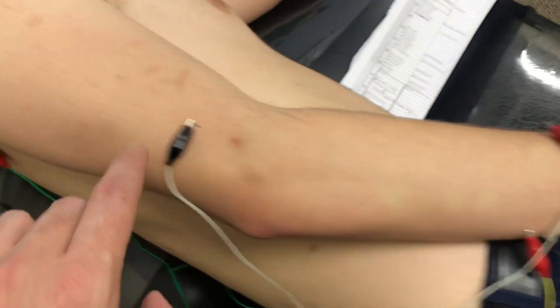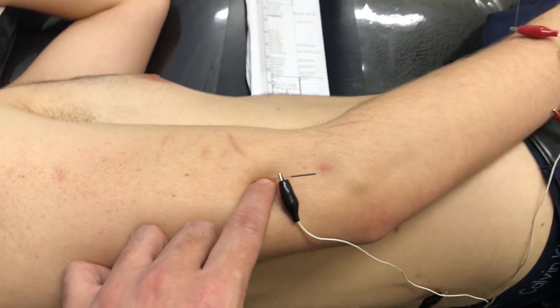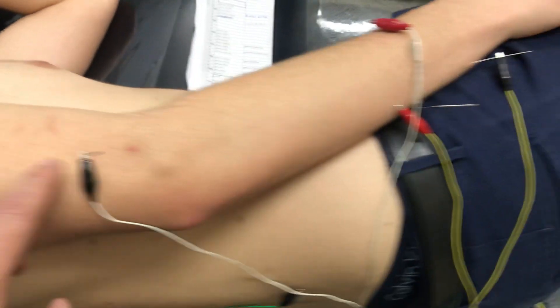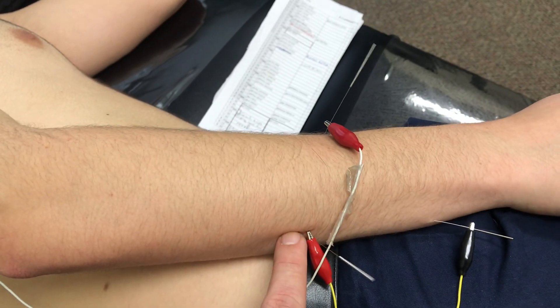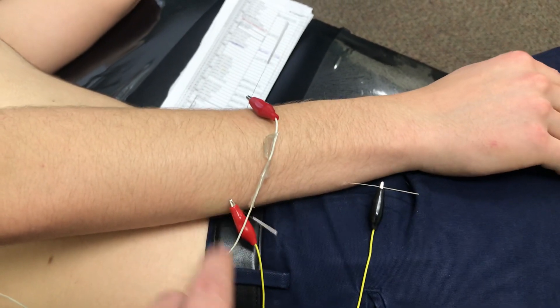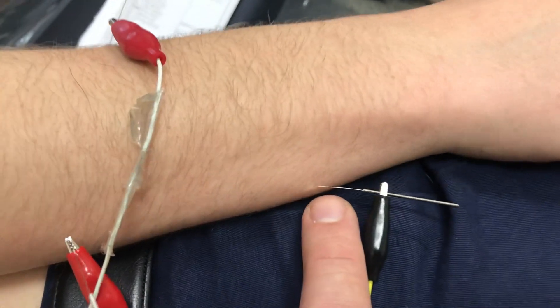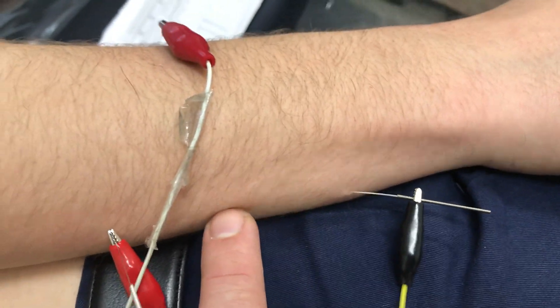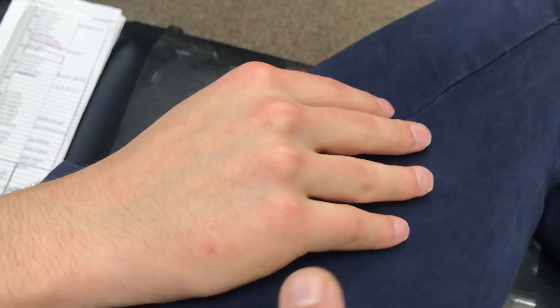And here's the radial nerve up near the lateral intermuscular septum. This one here is just into an arbitrary point in the flexor carpi — it's really not in a motor point at all. It's just to complete my circuit.